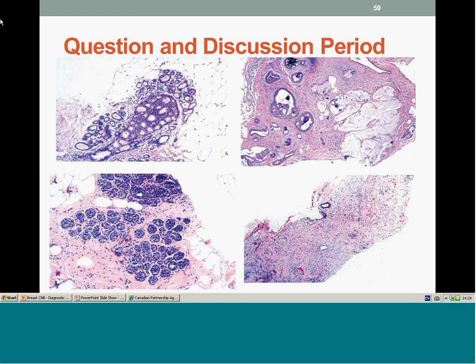And then there's the other big area, which is spindle cell lesions, in which you want to rule out spindle cell metaplastic carcinoma and the like. You need P63 and a variety of keratin markers and so forth. I think immunohistochemistry in breast pathology is a whole talk in itself, but those are the key ones that I would suggest.